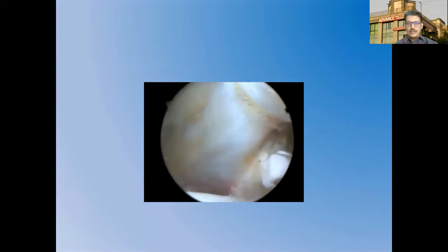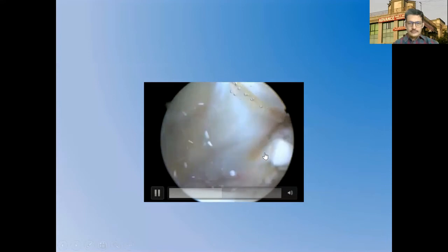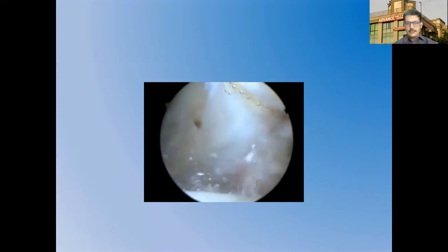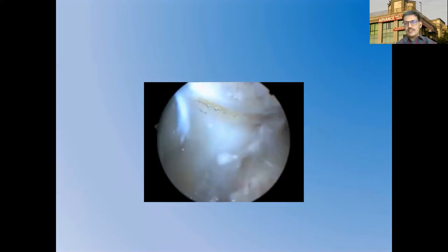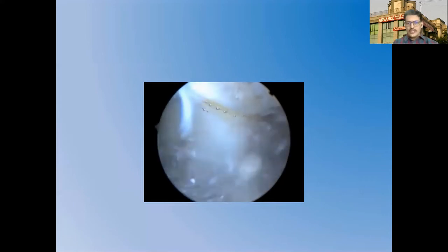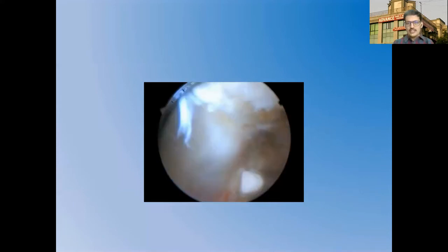All of the calcification is exposed thoroughly — it is located just below the labrum. Small calcium granules are coming out. The calcium is located in a pocket just between the labrum and the capsule. A good generous release is performed and the joint is washed out, removing all the pathological calcium — similar to calcific tendinitis deposits seen in the shoulder.